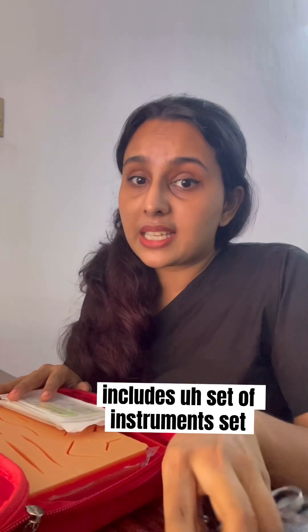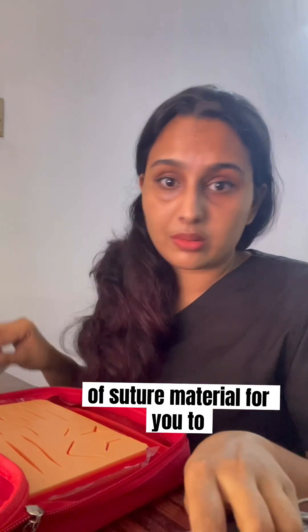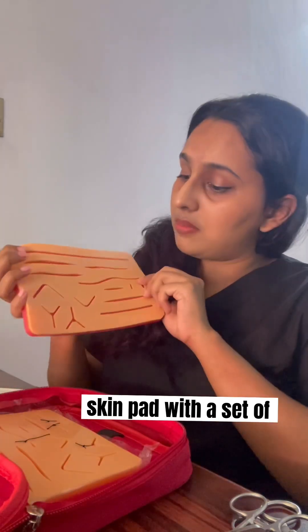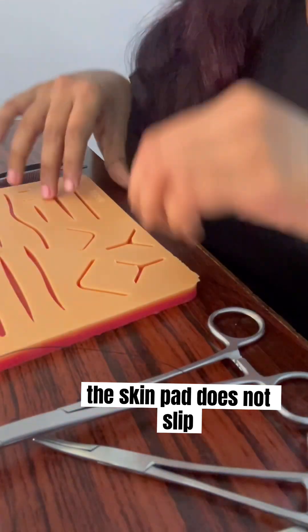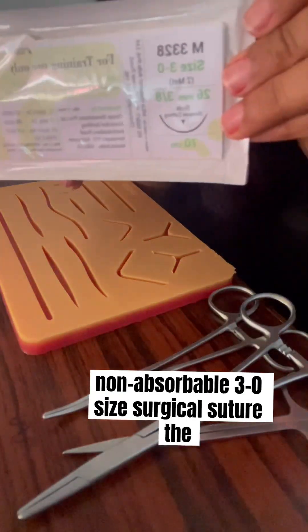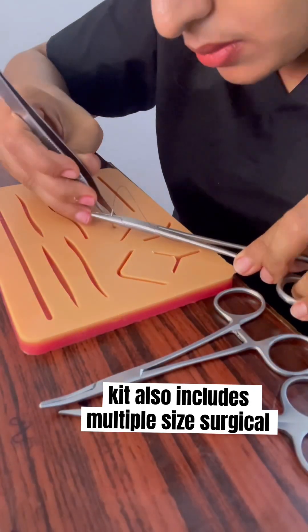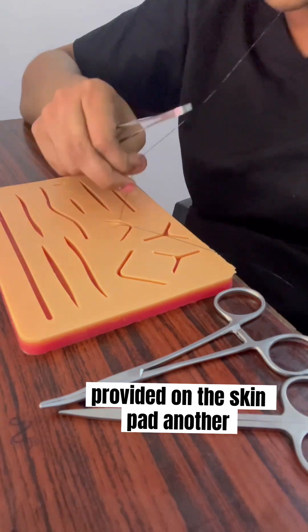This kit includes a set of instruments and suturing material for you to practice with. There's also a skin pad with a set of wounds that are artificially made in it. It is very convenient that the skin pad does not slip off the table when you're using it. Right now I'm using a non-absorbable 3-0 size surgical suture. The kit also includes multiple size surgical sutures for the different sized wounds provided on the skin pad.